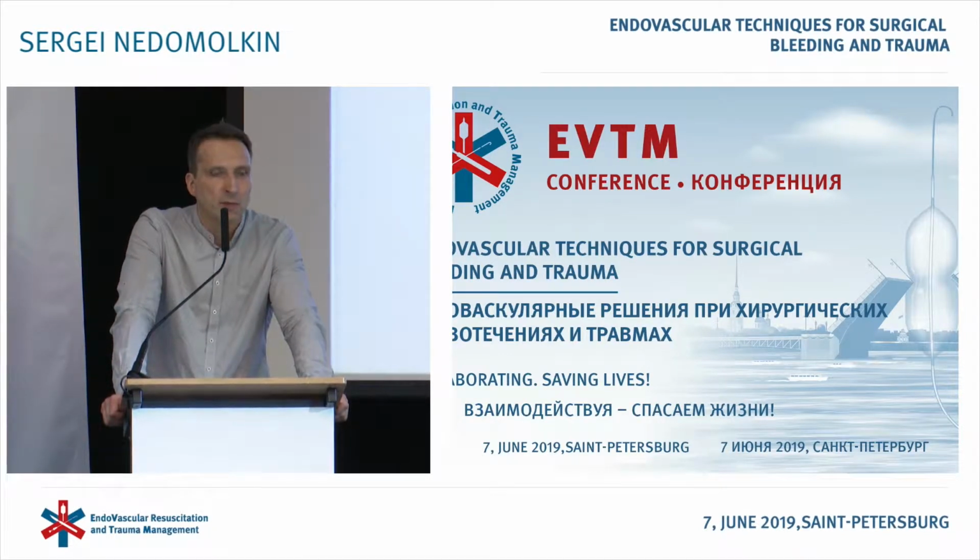The invasive approach to measure arterial pressure is also indicated for patients who are hemodynamically stable, but have internal hemorrhages of unknown origin or location. Patients with concomitant cardiovascular pathologies can have an invasive catheter preventively, and the method of choice is a radial approach, and ultrasonic navigation can also be a supportive method.